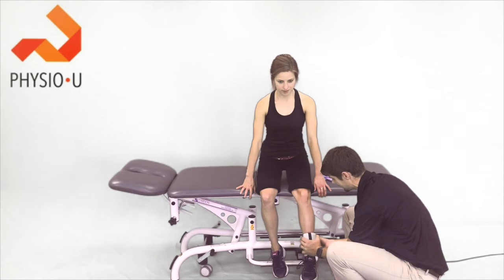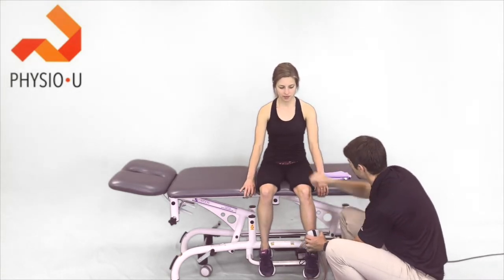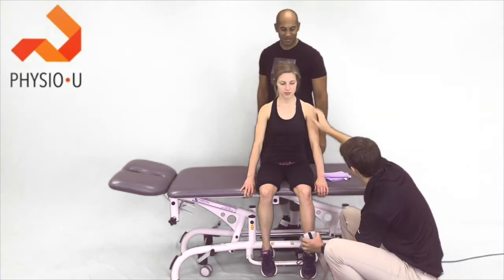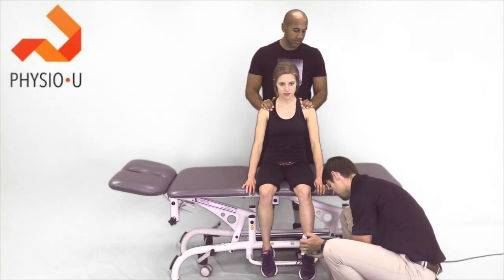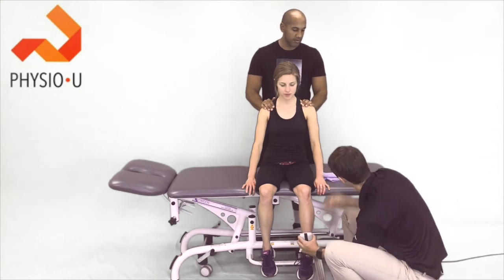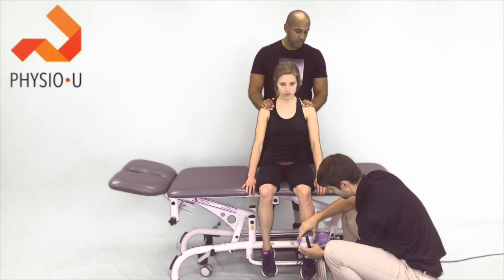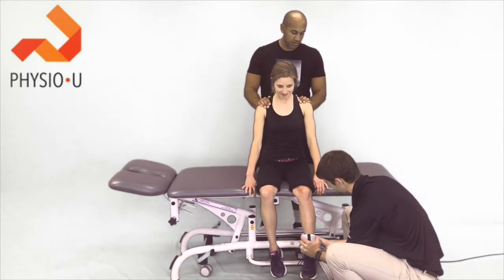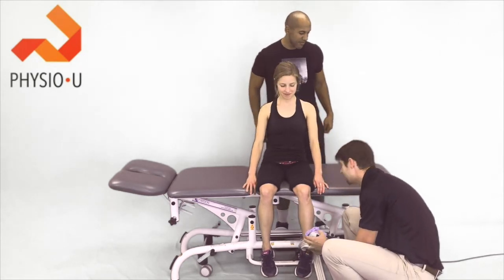The patient kicks out maximally against the dynamometer — come on, come on — and relax. Good. 118 pounds. Nice.